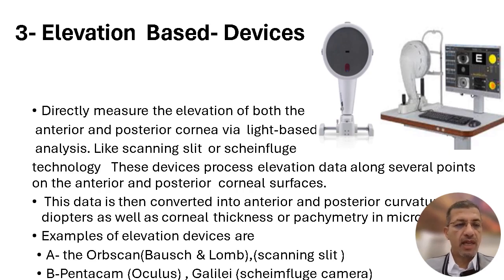The main elevation-based devices are the Orbiscan, made by the Bausch & Lomb company, and its family. I will explain the progression later on about the Orbiscan, from Orbiscan 1, 2, 3, and then the Pentacam. They use different principles. The Orbiscan uses scanning slit technology, the Pentacam uses Scheimpflug technology, and the Galilei uses a dual Scheimpflug camera.